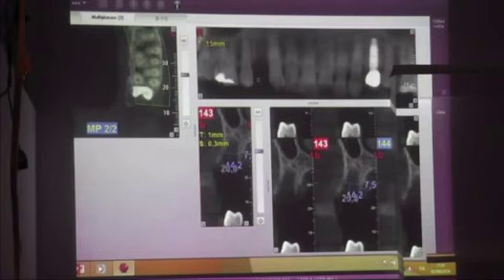But really, if I have 10 of length, it's 10. For me, it's very easy to choose the implant, the diameter. For this, I speak about the radar. Is this possible to have in the future?